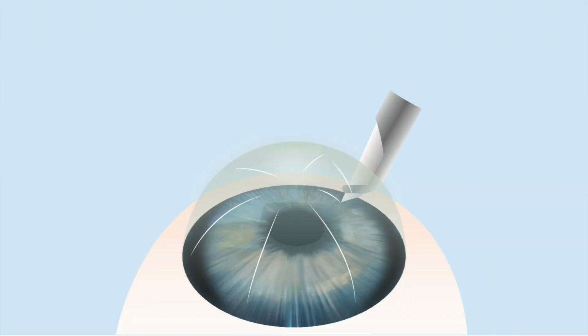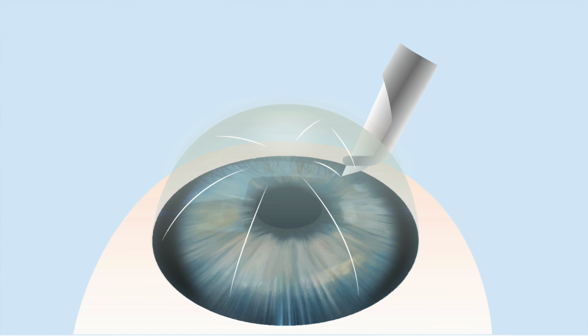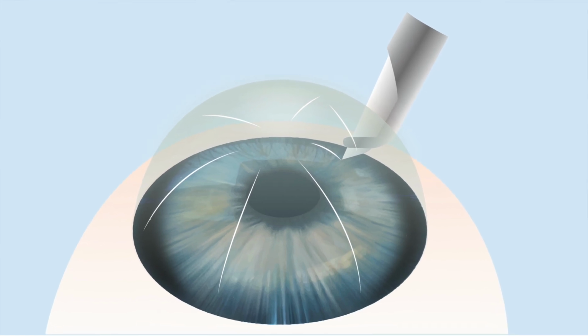So the first major leap was out of Russia. Fyodorov invented radial keratotomy, or cutting the cornea in vertical incisions so it could change the shape and the power of the cornea. It was brought to United States, and then within a few years it was realized it does not give very exact results, and the results are not stable over time. At that time, laser was being developed, and then it was applied to the cornea, first initially in non-sighted eyes, and that was the birth of PRK.